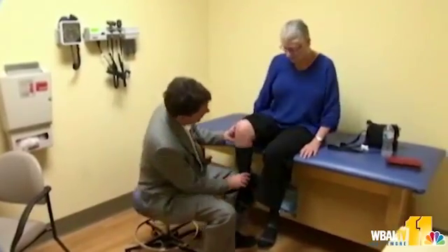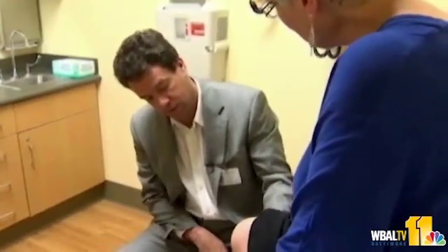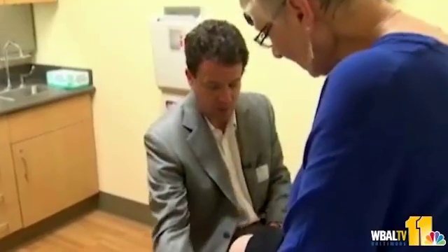Additional treatments didn't help. Sue consulted with Mercy Medical Center's Dr. Mark Hungerford about a new robotic procedure called Makoplasty to replace part of her knee.